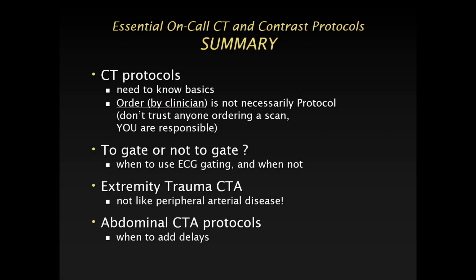All right. Let me just summarize here, so they also have 2 minutes for questions. CT protocols all reside on the scanner, they encompass all the acquisitions for a given study, and you do need to know at least some of the basics. So you need to know approximately what kind of non-con, arterial or portal venous phases are part of the protocol. Also important, an order by a clinician is not necessarily the protocol. So you don't trust anyone ordering a scan, because in the end you are responsible, and you'll be talking to the judge if anything goes wrong, not the ordering physician.